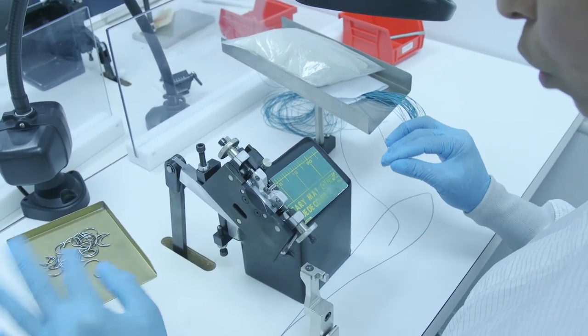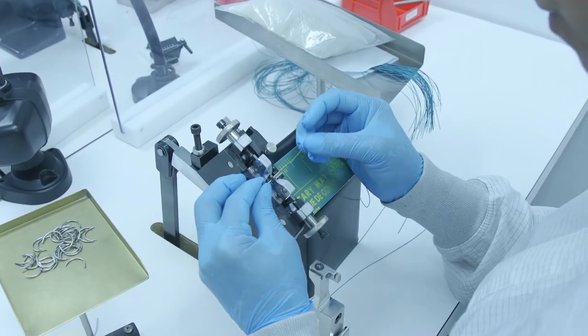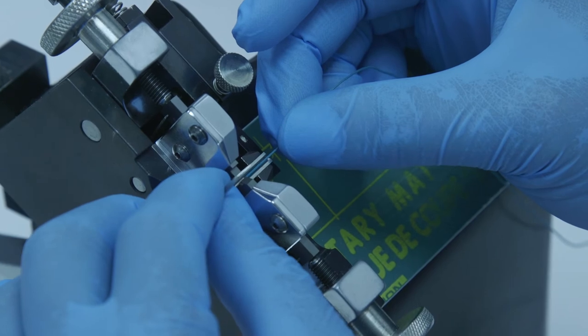we proceed to attach. We put the needle facing up, we grab the suture, we insert between our dies, and on this occasion we're going to do a single strike.